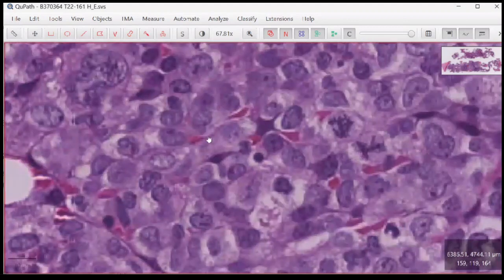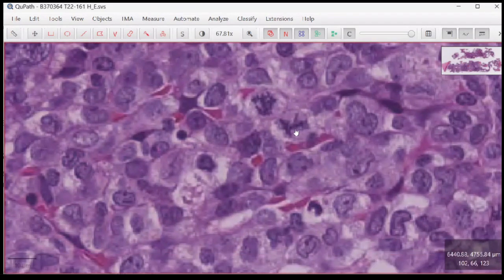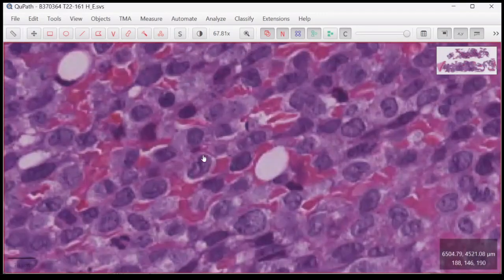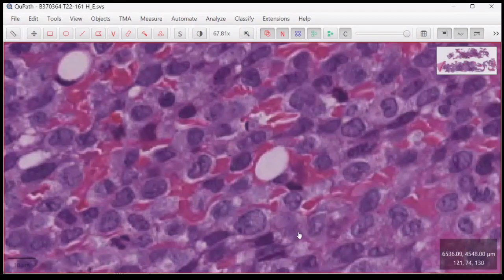They are the predominant cell, plus they are having quite brisk aberrant mitosis. Okay, they are having monocytic differentiation. Quite easy, it's a good thin section. And this is acute leukemia, probably with monocytic differentiation. Then we move to MPO.